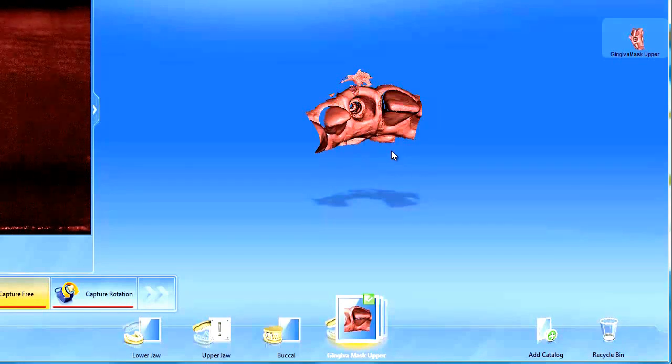The reason we use it, or kind of push for using the soft tissue, is that way we can remove it and put the implant or the tie base in place with the scan body, and we can visually check it and be 110% sure that that tie base is all the way down.